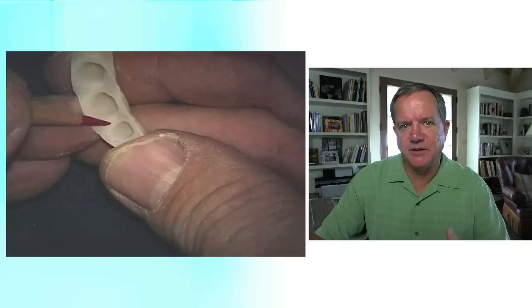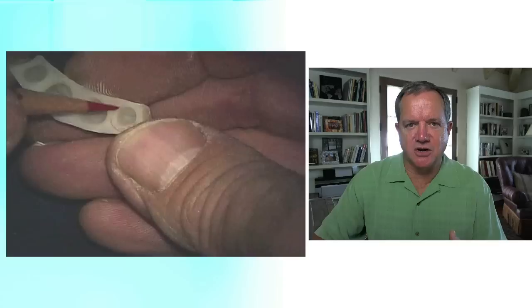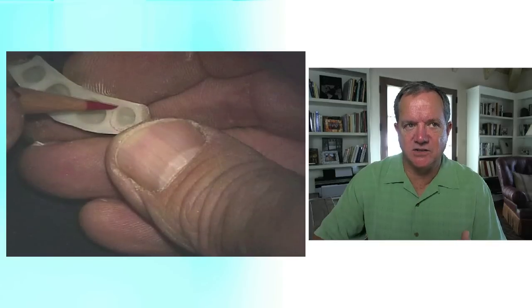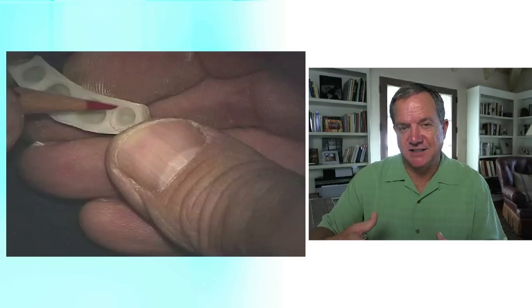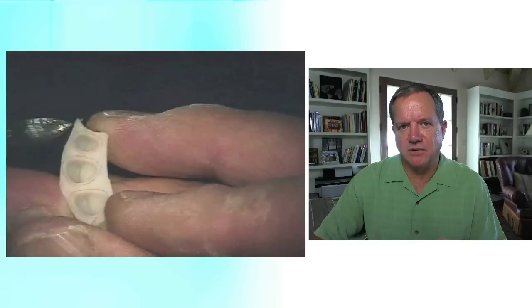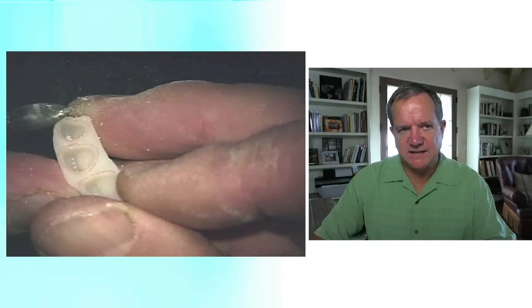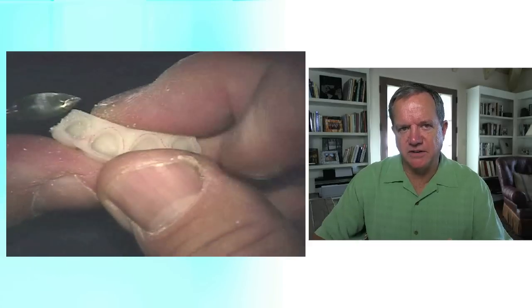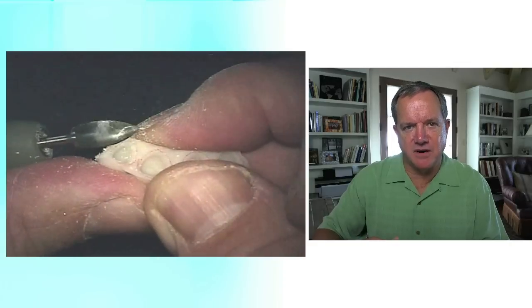Now I'm going to do a rapid gross trim of the facial and lingual, but I do like to mark the margins as best I can using a red wax pencil. In truth, when you do your first bulk fabrication of the temporary, the materials shrink, and your margins may not fit as well as you'd like. Once I've got them marked, I'll use that flame-shaped burr for a gross trim, because what I'm really going to do is reline the margins right on that model.